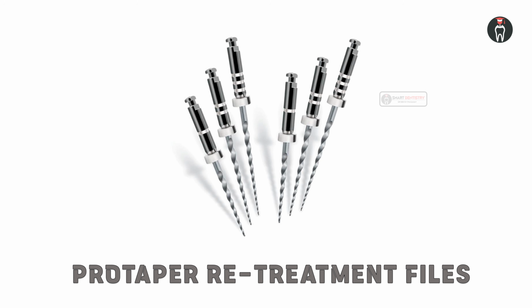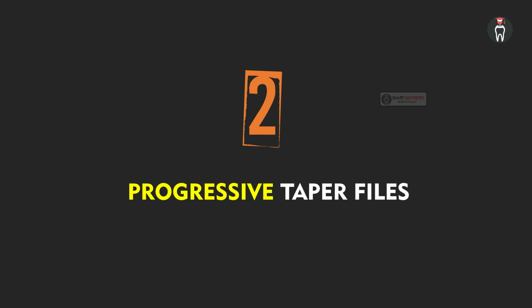Retreatment files should be used only for the removal of gutta percha from the root canal system and not for cleaning and shaping. So any file which has an active cutting tip or a sharp tip should be avoided. All rotary files which come with a passive tip or non-cutting tip should be used for cleaning and shaping. That will minimize and prevent the screw-in effect.